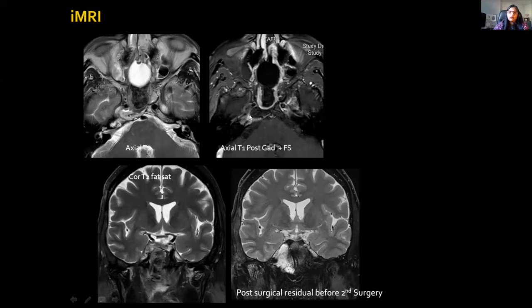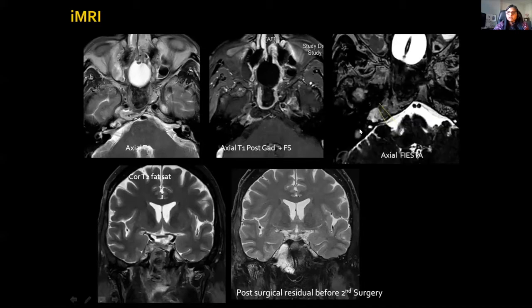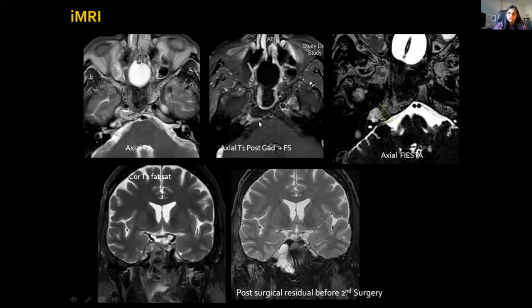Looking back, we note a small volume of residual tumour, nicely demonstrated on the FIESTA sequence — seen behind the post-surgical scar tissue, which appears as an area of low T2 signal intensity with fairly homogeneous enhancement, as this is now a few months post-op.